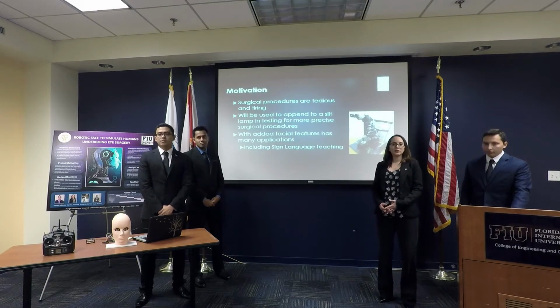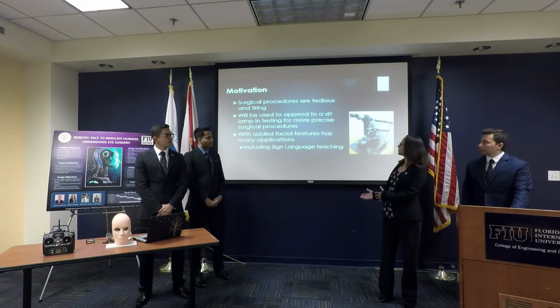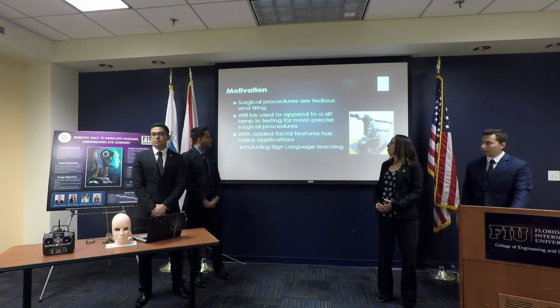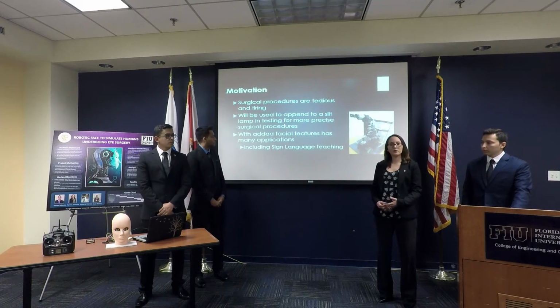So the main motivation for creating this was because surgical procedures are very tedious and tiring. A doctor created a prototype slit lamp, seen in the picture on the right, that needs to be tested. So in order to test it before human trials, it needs to be tested in a different way. So that's why this robotic face to simulate that was created. Another reason was if we were to add more facial expressions to the face with robotic eye movement, it can be used in other applications such as for sign language teaching.